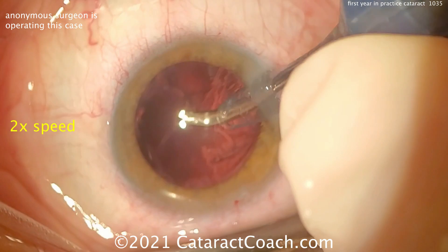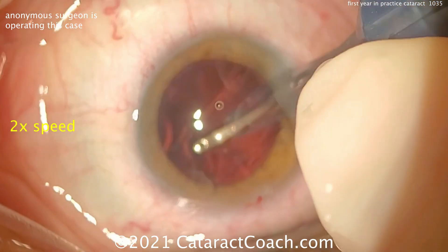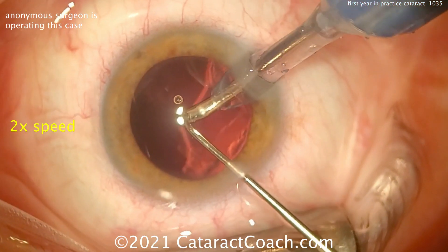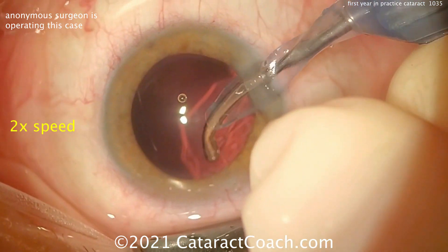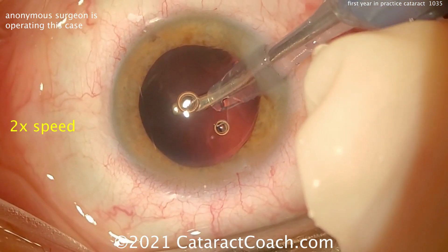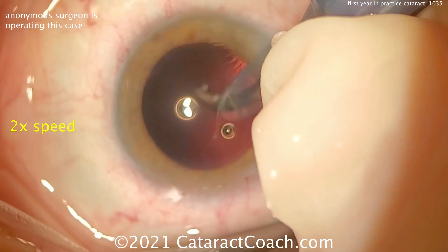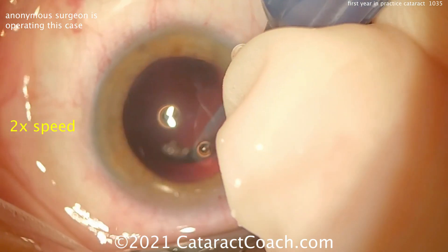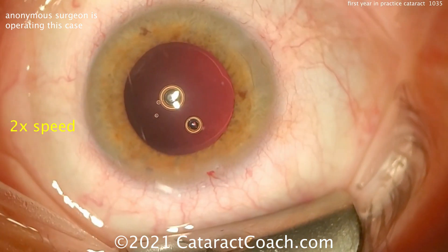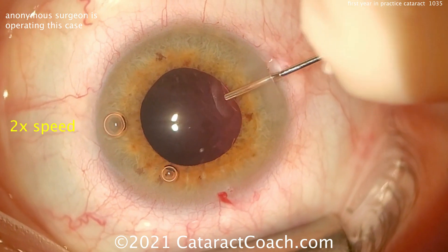Now let's see cortex removal here with coaxial — that's nice and efficient, cleaning up very nicely. This is another video that was recorded via a cell phone or mobile phone attached to the ocular of the assistant scope. That's a very good technique — if you don't have a built-in high quality video recorder, your phone for sure has an HD video camera built in, maybe even a 4K camera. The capsular bag is nice and clean.